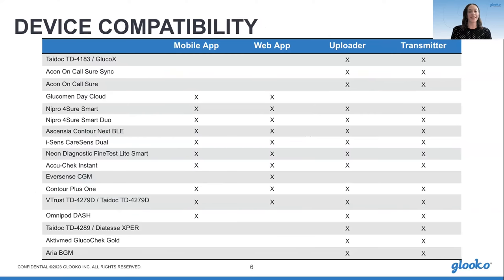This next slide shows our ever-increasing device compatibility, with a list of the 21 new devices added this year. We are compatible with over 95% of diabetes devices on the market today. For more information on device compatibility, you can visit us at gluco.com/compatibility to learn more.